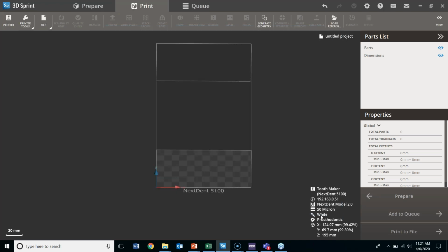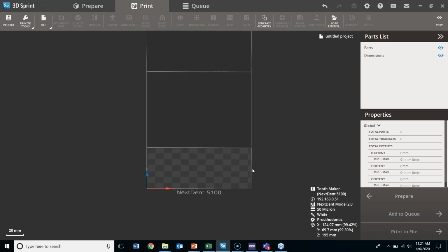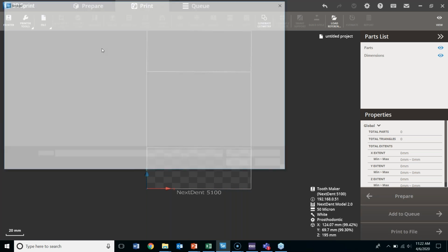And it's all the same accuracy between white, gray, and peach. It's all a matter of preference. So if you want to be able to see the contours, or you want white for patient presentation, I don't know, I like gray for my anteriors, and even peach is good too. But peach doesn't pull as much gray color into your all-ceramic crowns, so peach is a favorite as well. And File or Control I is your hotkey for that. And then hit open, or import, excuse me.